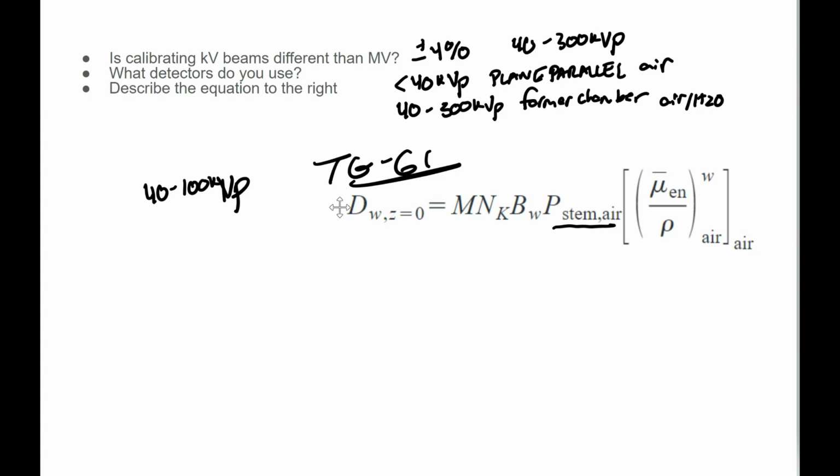So let's talk about setup. We mentioned 40 to 100 kVp. We're going to do a 2 centimeter depth. And, I'm sorry, going back, I got carried away. It's very easy to think about this, as there are two equations in TG61. The other one is in water, and I was thinking about water. So go back: no depth. We have no depth here.